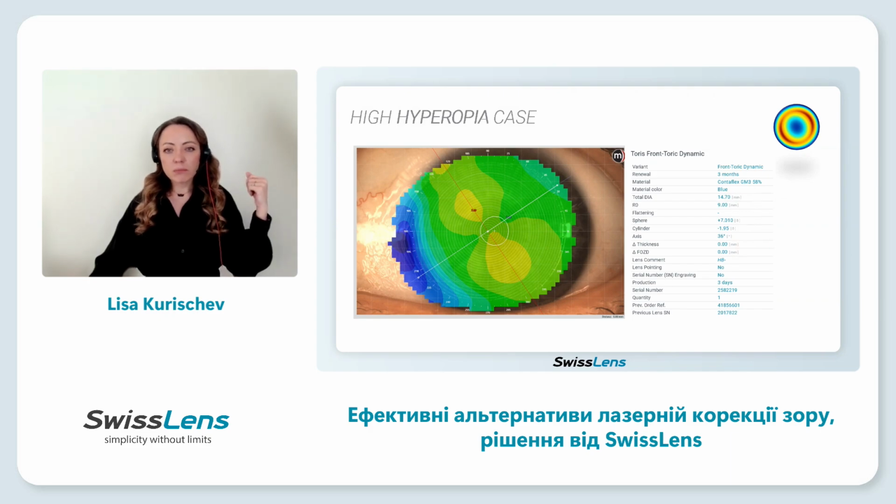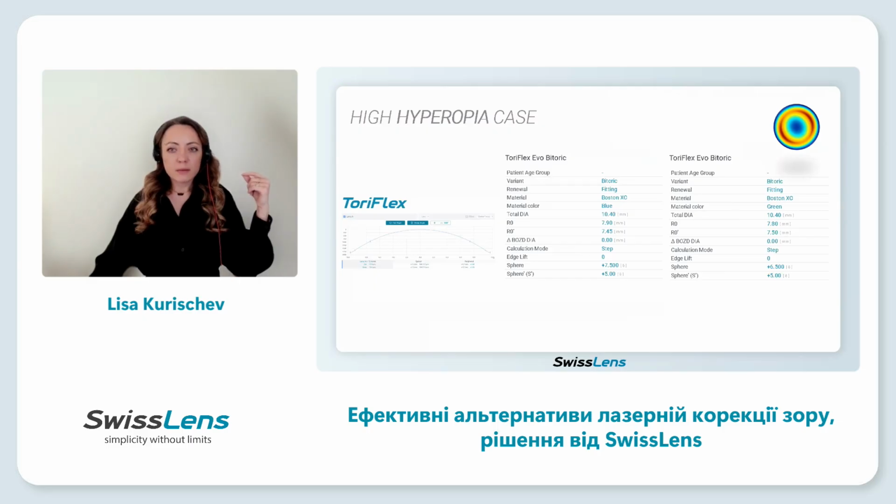It was fine, the vision was good, it was comfortable, but only in the morning. It turned out he has really dry eye, so he couldn't wear the lens all day. What we did, we switched to RGP lenses, our new Evo design. We heard about it from Thomas today.